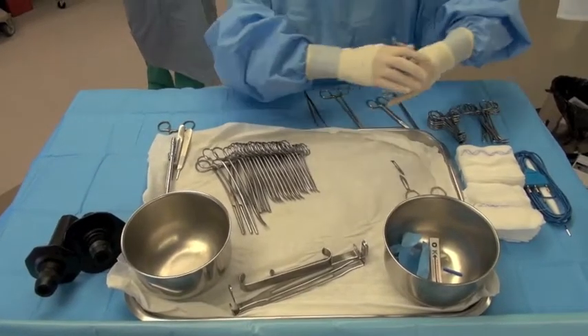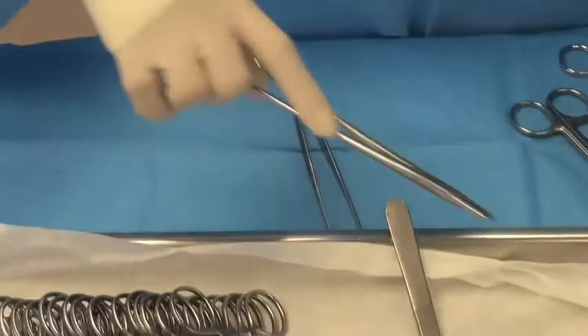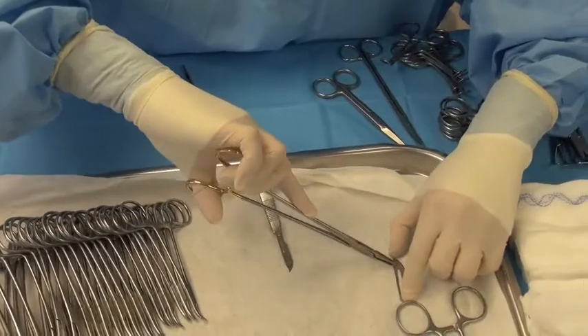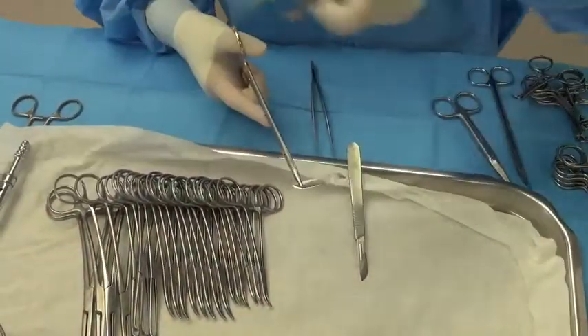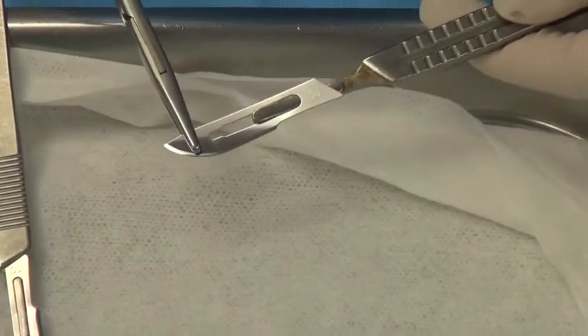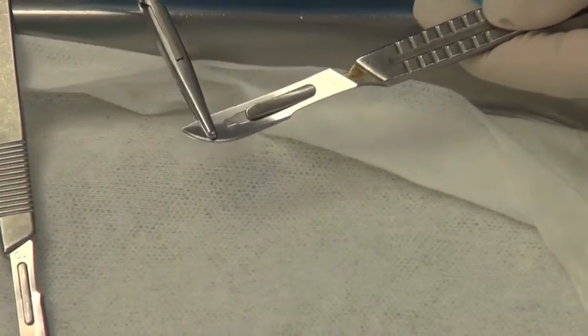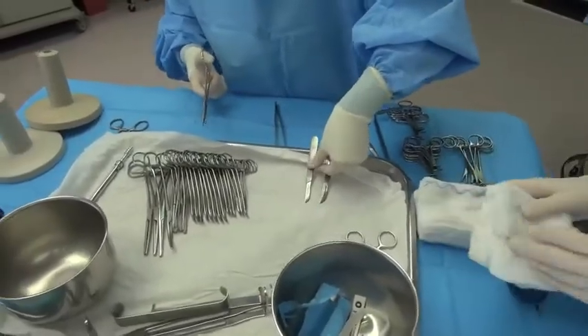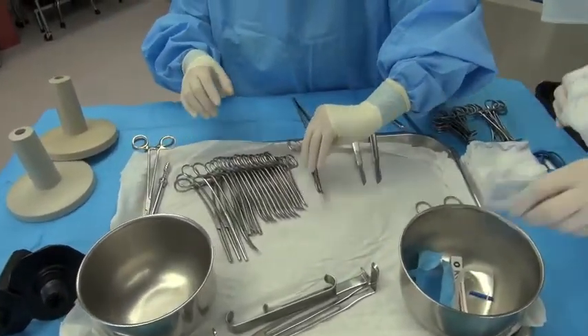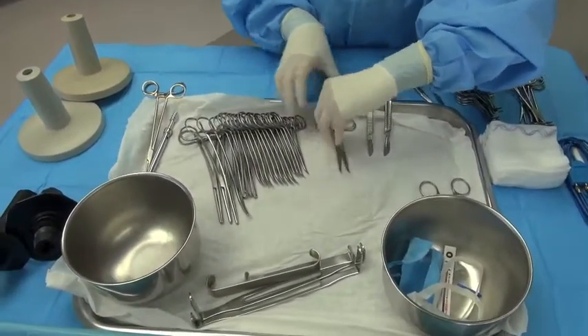You want to make sure that you go over all your instruments during this period. This is the proper technique for placing the blade onto the handle. As you can see, the surgeon is not using their fingers to do this, but is using the needle drivers to help secure the blade onto the handle. This allows you to reduce the chance of contamination.